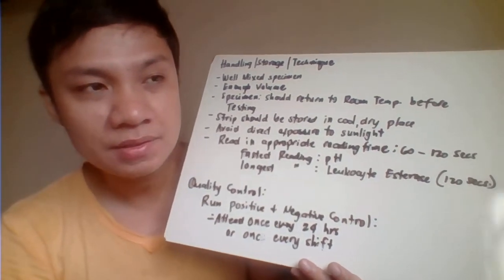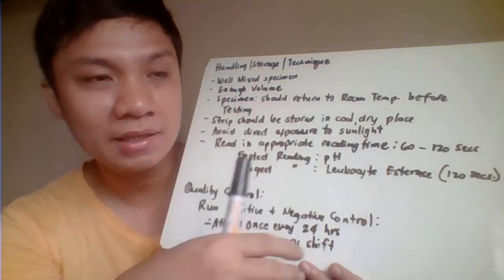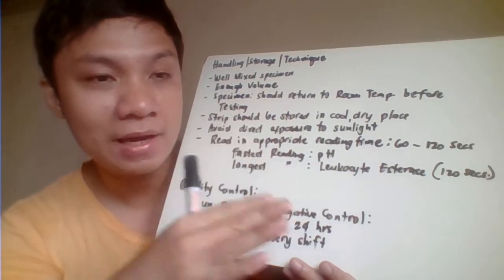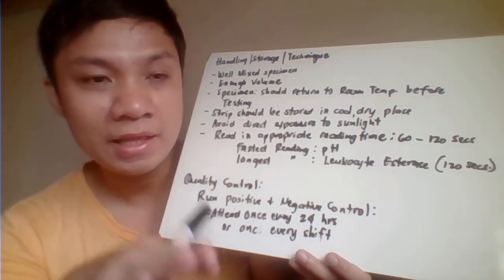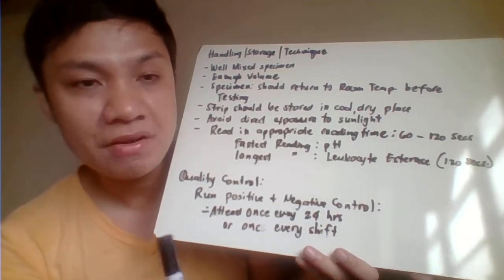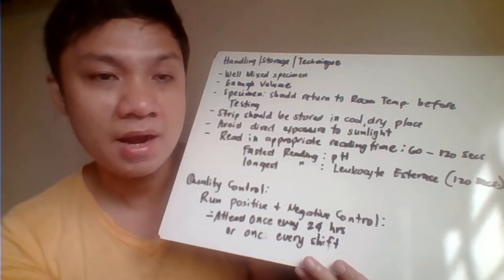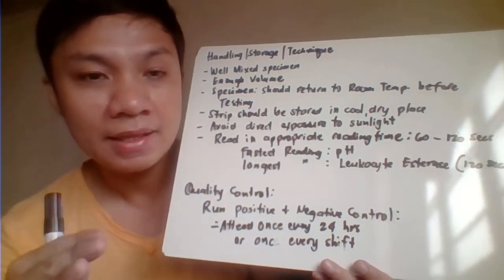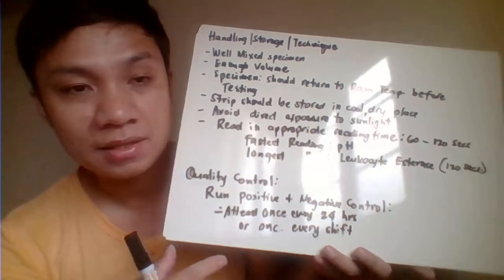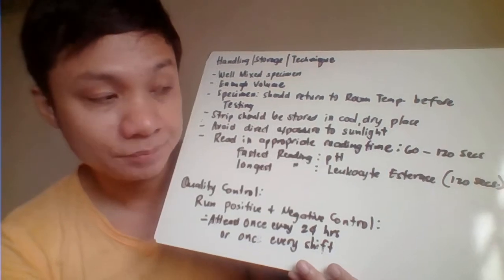Most likely, parang ina-estimate na lang natin ang reading time. Because of course, di ba may recommended na mga reading time for each of the test pads. Hindi natin kaya na susundin yun lahat-lahat. Basta, you should not read beyond that 120 seconds. Because if you try to read your result for a longer period of time, upon exposure to the air, nagkakaroon ng discoloration ang ating test pad, nagda-darken ang ating result with your color change. And eventually, that would not provide you with the correct interpretation of your results.